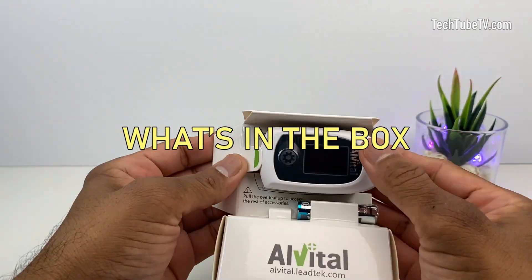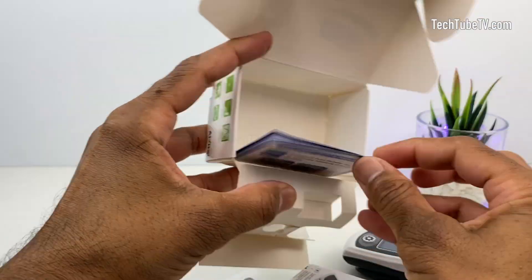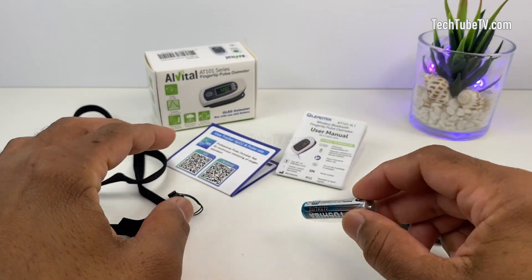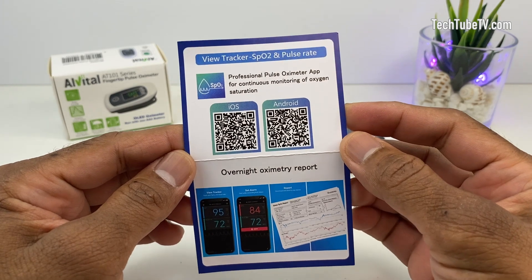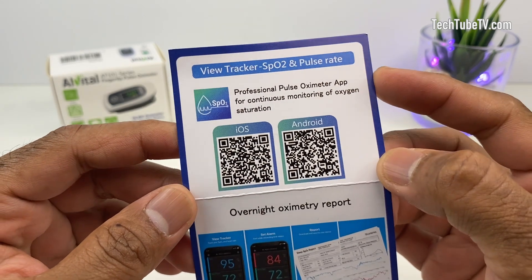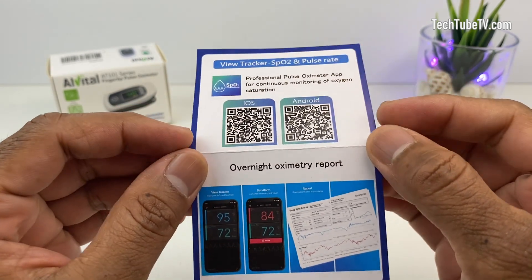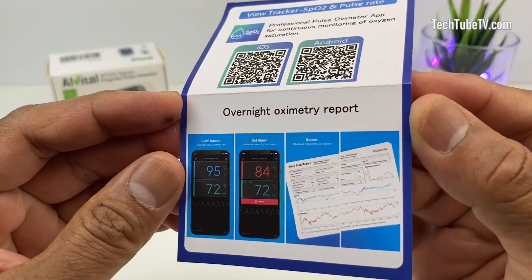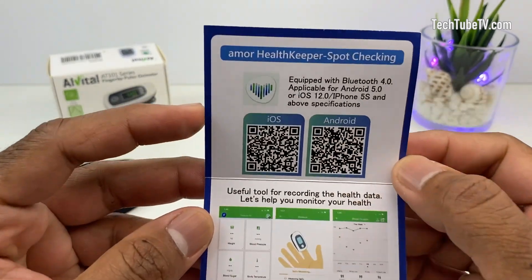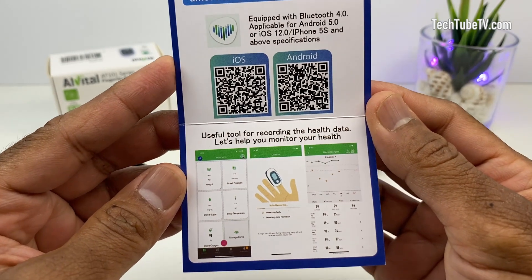Let's open the box and see the contents. This is the Alvital pulse oximeter. It comes with a triple A battery and a lanyard. This card shows that there is a professional pulse oximeter app for continuous monitoring of oxygen saturation. The app is available for iOS and Android, and it looks like you can use it while you sleep and get an overnight oximetry report. On the other side is another app called Amore Healthkeeper, which seems to be a tool for recording and monitoring your health data.